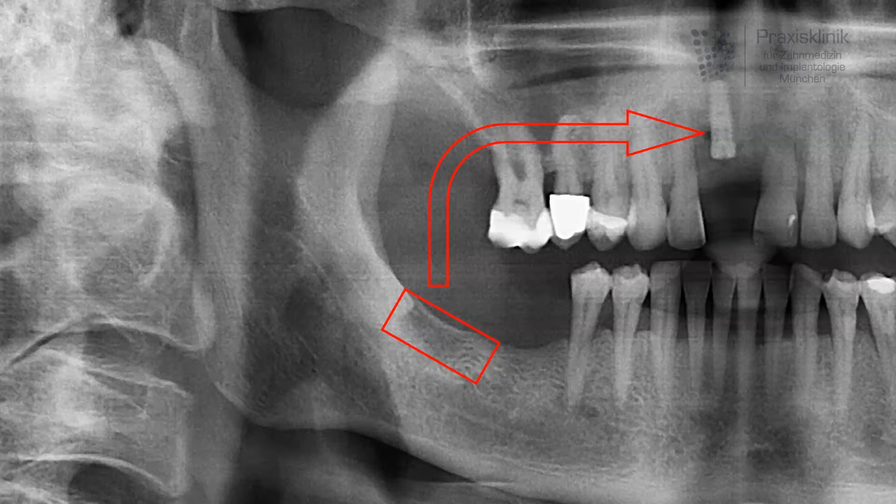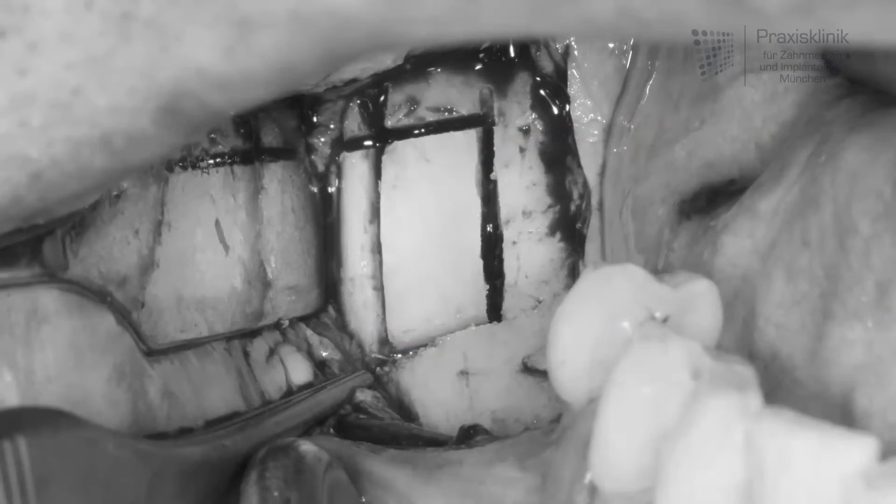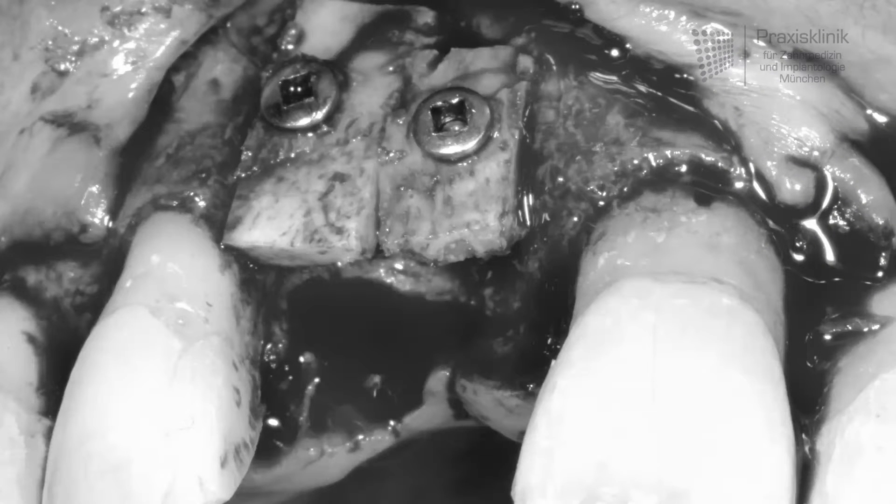This intraoperative picture shows how the bone block is separated from the lower jaw. To free the bone, oscillating instruments and very fine chisels are used. Now the bone block is transferred to the recipient site of the upper jaw, where it is adapted to the geometry of the defect and the bone block is then fixated by two titanium screws.